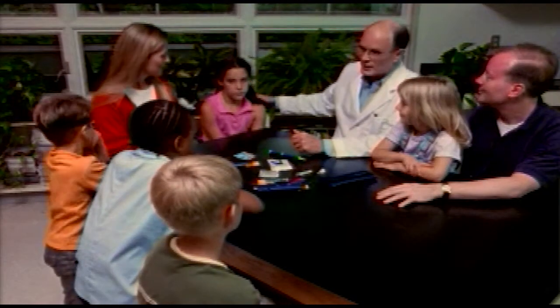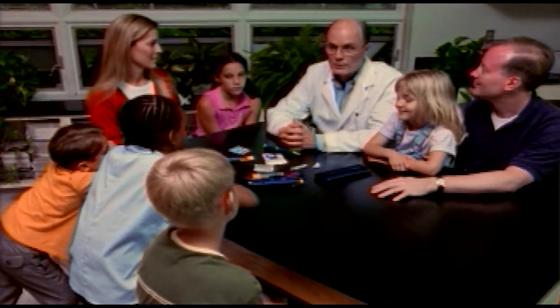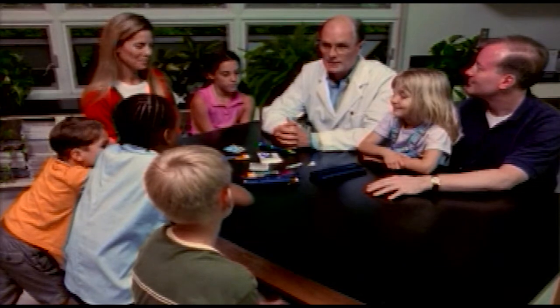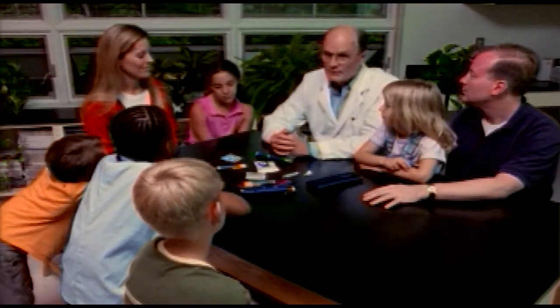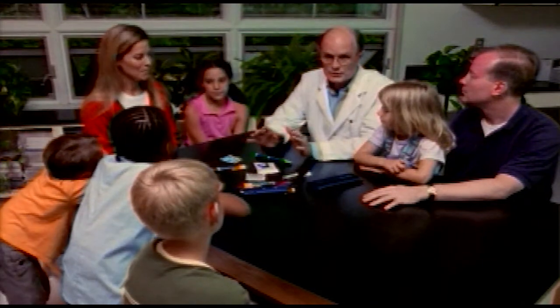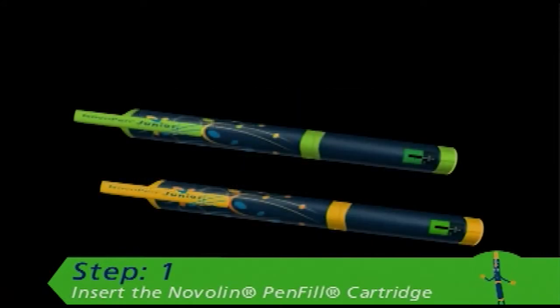Sam has volunteered to help us out, along with her mother. Samantha's been a patient of mine and has been using the NovoPen Jr. diabetes management system for a couple of months now. She says it's pretty easy to use, and all her friends like the cool design. First, let's go over how to insert the Novolin pen-fill cartridge. Before you do that, make sure you have the type of insulin that has been prescribed for you. If you use two types of insulin, NovoPen Jr. comes in two cool colors to help you keep them separate.